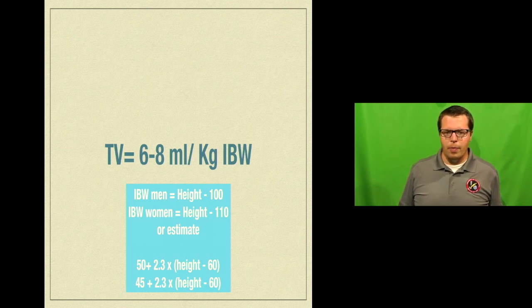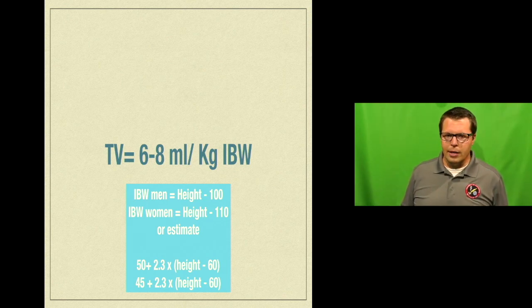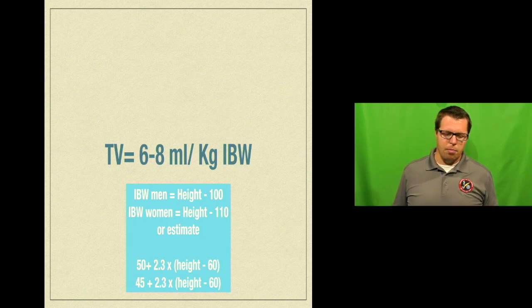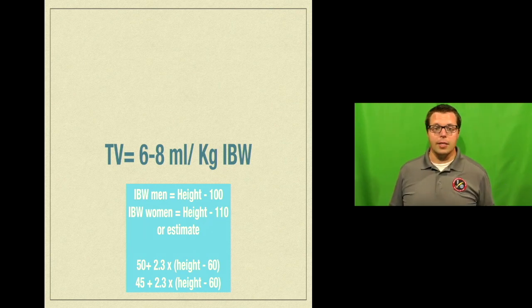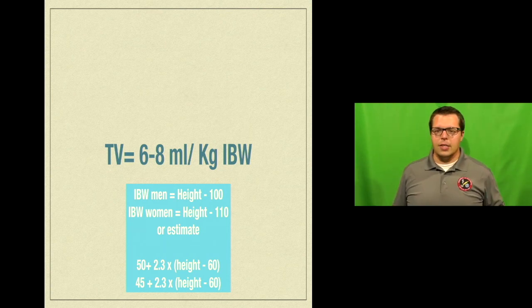That's your tidal volume. So where in the past we used to put people on 600, 700, 1,000 milliliters for each breath, what we should really be doing to keep them safe is something between 400 and 500 for the most part. If your ideal body weight is 100 kilograms, which is a really tall person, then they might need as much as 600 milliliters.